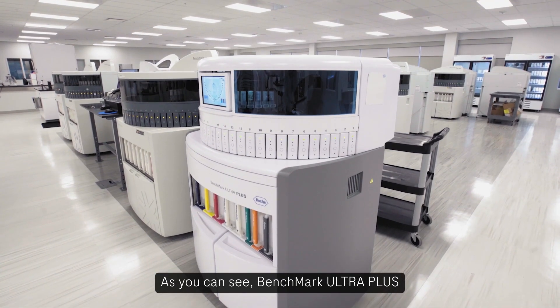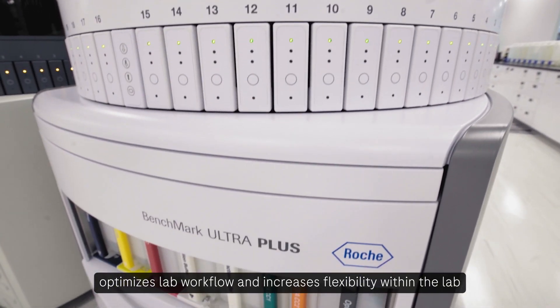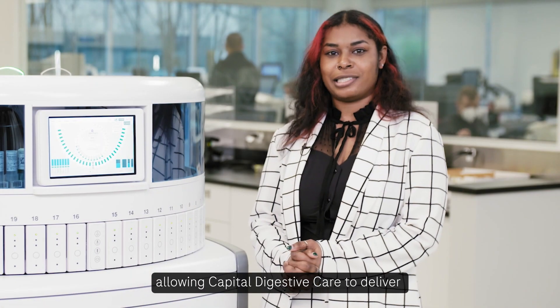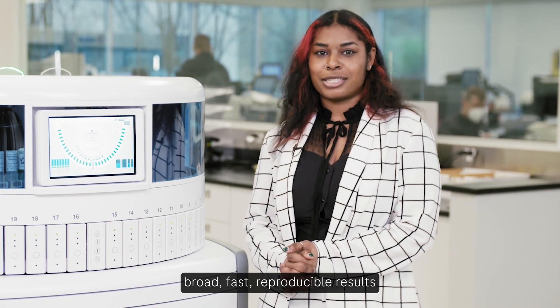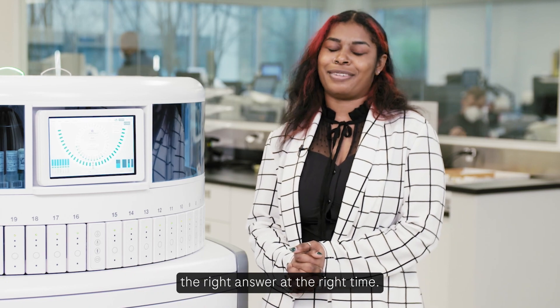As you can see, the Benchmark Ultra Plus optimizes lab workflow and increases flexibility within the lab with the quality you expect from Roche, allowing Capital Digestive Care to deliver broad, fast, reproducible results that help our patients get the right answer at the right time.